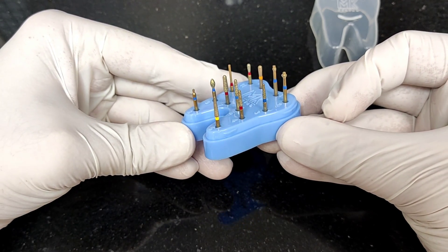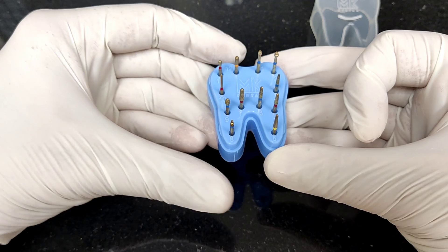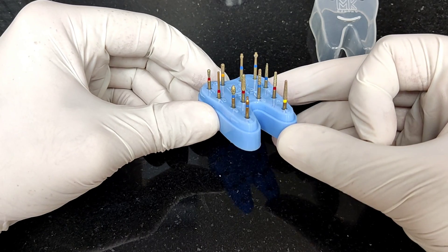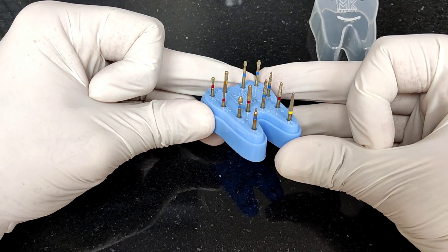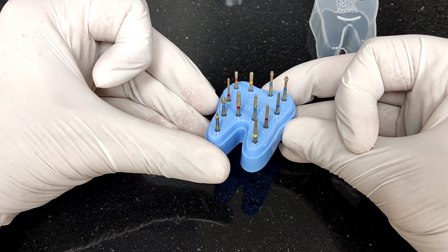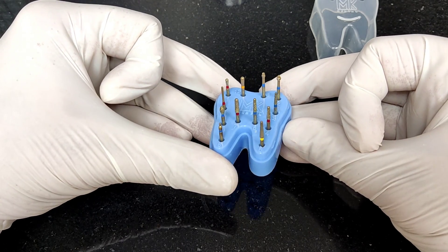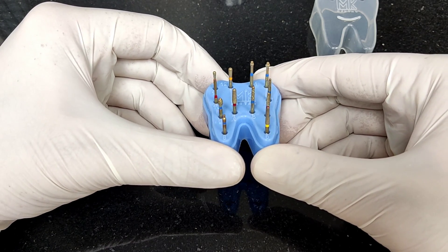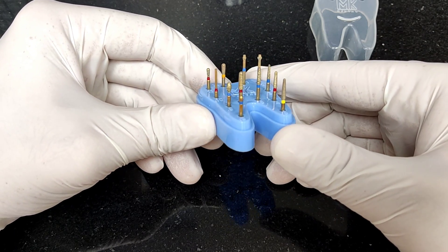Each burr has been carefully designed for tooth preparations with conservative preparation protocols in mind. This kit is universal — you can use it for anterior and posterior tooth preparations, as well as for fabrication of porcelain veneer restorations, tabletop inlays, onlays, and overlays. One single kit covers both anterior and posterior preparations.